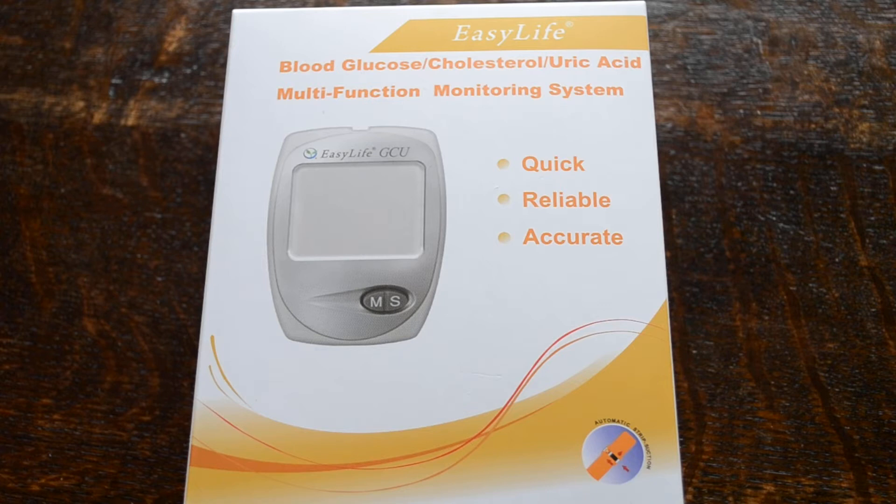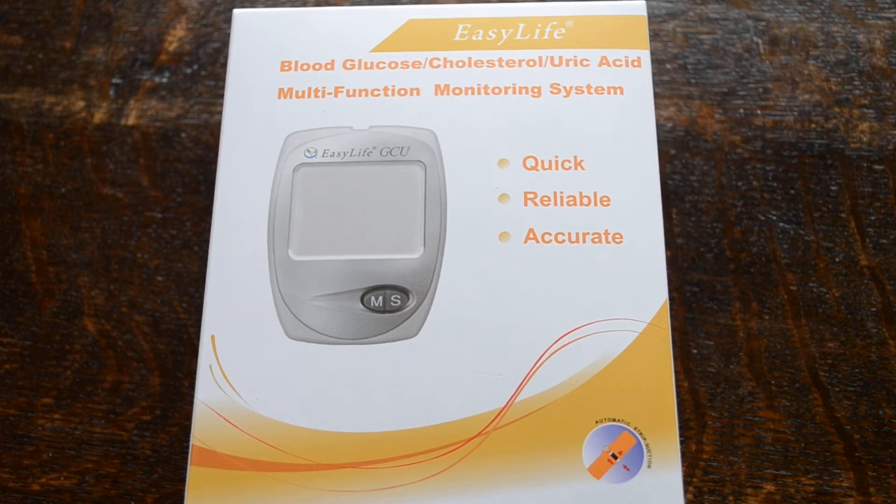Blood glucose is obviously extremely commonly tested for. Cholesterol has been available as a home test with a blood sample analysis for a number of years, but this meter system really does offer a breakthrough in the cost of doing a total cholesterol test. It also gives you a function for uric acid, which is new to the UK and hasn't been previously available as a home test. Uric acid is a chemical that causes gout, and it's very useful for patients that experience gout to be able to monitor their uric acid levels as a baseline and also to confirm the onset of episodes of clinical gout.